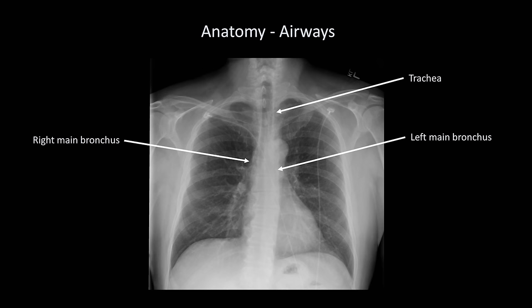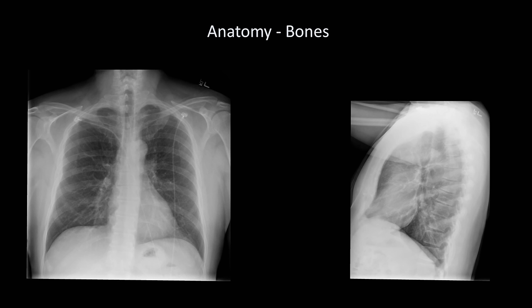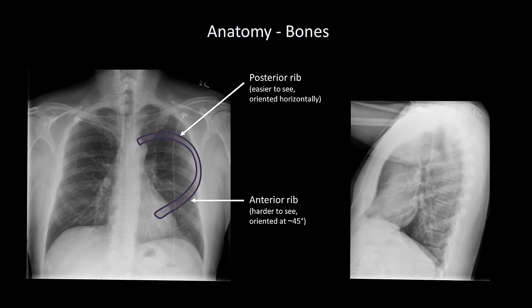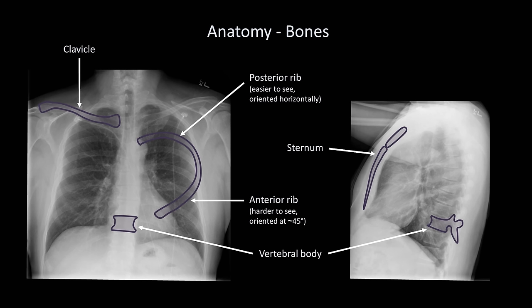I'll take the drawing away again so you can try to see the airways on your own. The next set of structures is the bones. There are four types of bones easily visualized on a PA and lateral x-ray set: ribs, which have posterior components oriented horizontally and anterior components at a 45-degree angle; the clavicles; the sternum, sometimes visible on the lateral film but often obscured by soft tissue; and the vertebral bodies, more easily visible on the lateral film but usually seen on the PA as well, provided technical quality is adequate.